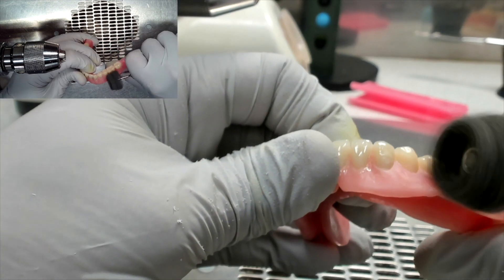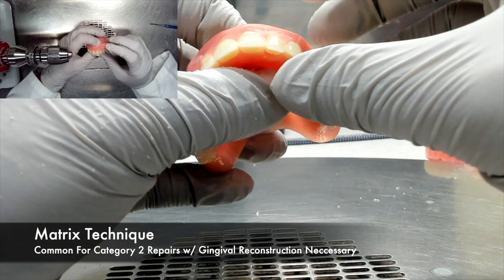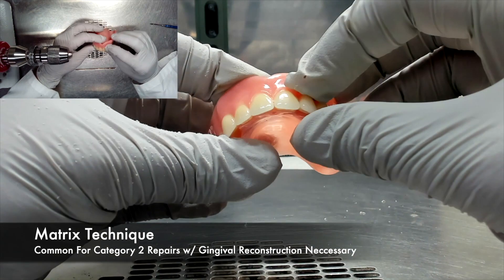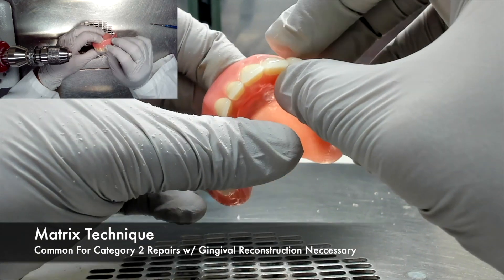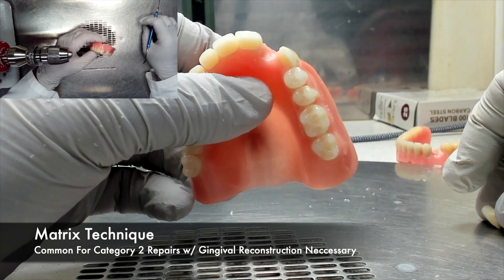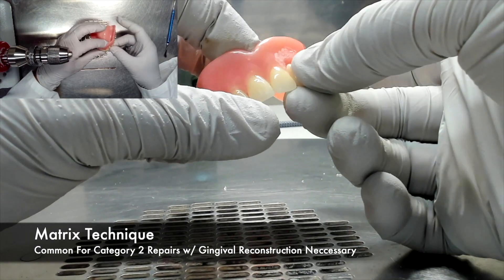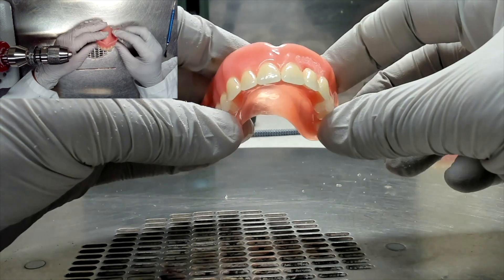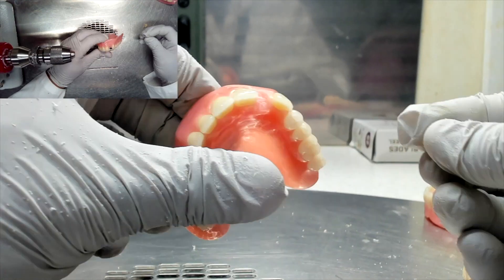However, there are repairs that will require you to make use of a matrix. The matrix technique is common for a Category 2 repair where gingival reconstruction is necessary. If a tooth has fractured off and taken some of the facial acrylic with it, all of that surface needs to be rebuilt. For an anterior maxillary tooth, this is very important and is probably better done using a matrix.